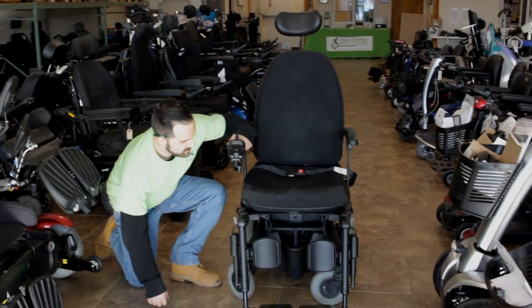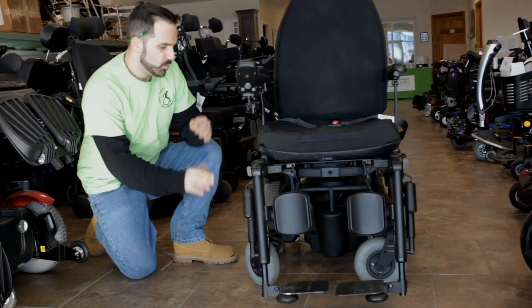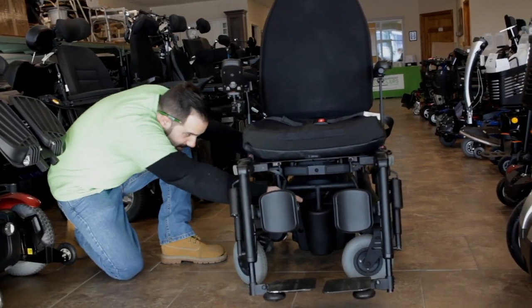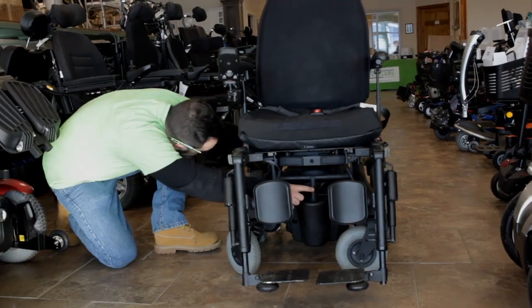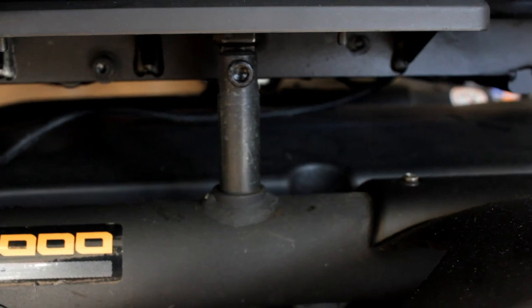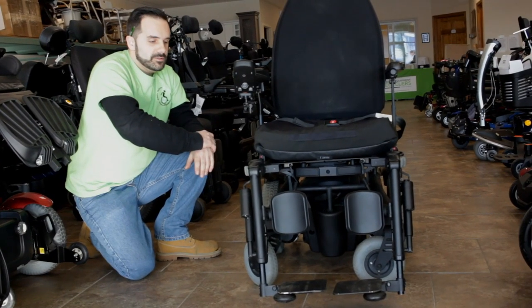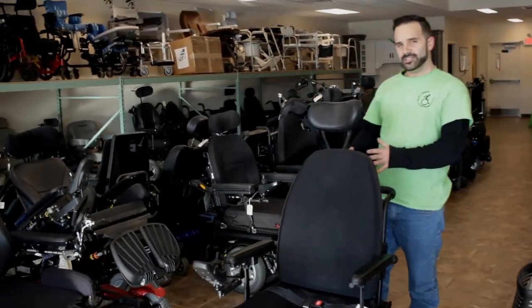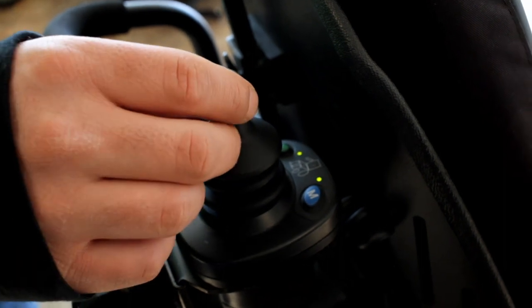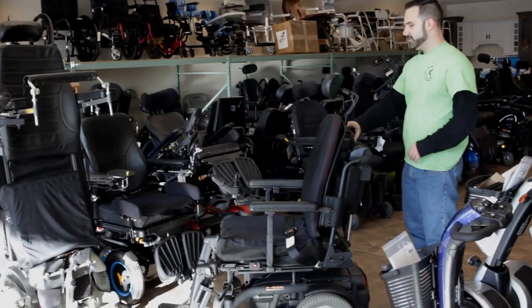The next thing which is good to highlight would be the adjustable nature of the seat. We can actually adjust this seat to floor height using this adjustment right here — there's one here and two on the sides — that we can raise and lower the seat height to where it is needed for the user. The caregiver can utilize this attendant joystick located in the rear of the chair to drive and also operate the power seating function.